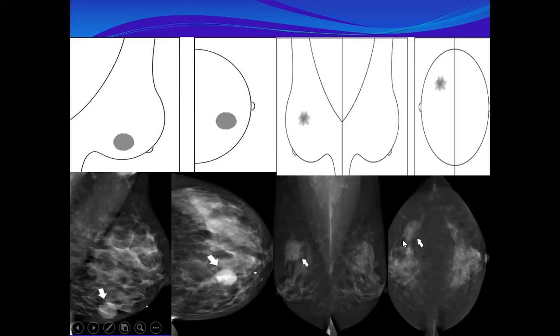And you can see the fat is going into the lesion like this, interspersed, going into these areas. There is some fat here, and here. If you look for a convex border, here it is concave, here it is concave, and here it is straight. It does not fulfill all the criteria. It's simulating a mass, but it is not a mass.